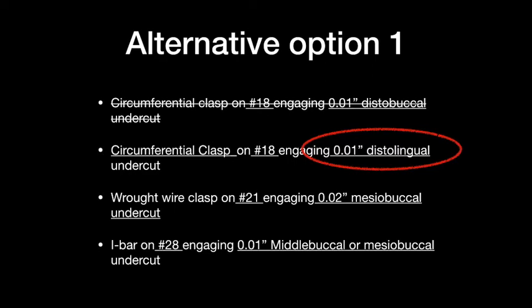That's very awkward. But this design still fulfills the criteria for the retention part. But for the patient's comfort, that's not an ideal design. That's why I said in the first part, if you draw the first one, that will be the ideal. If you draw this one, it's probably not the ideal one.